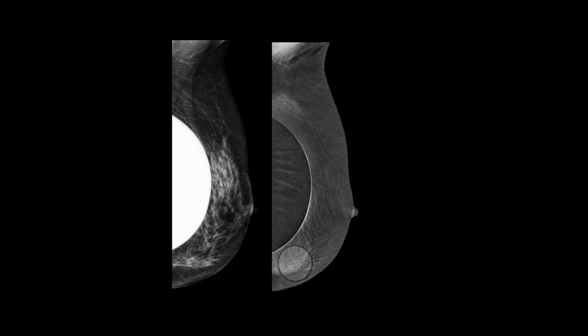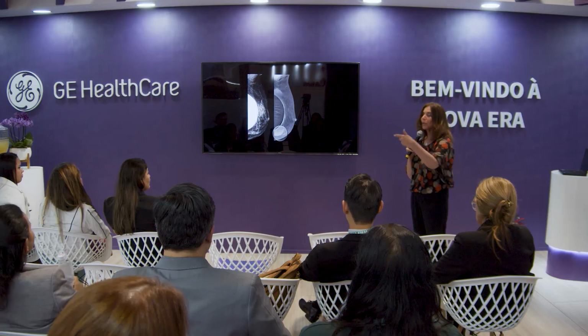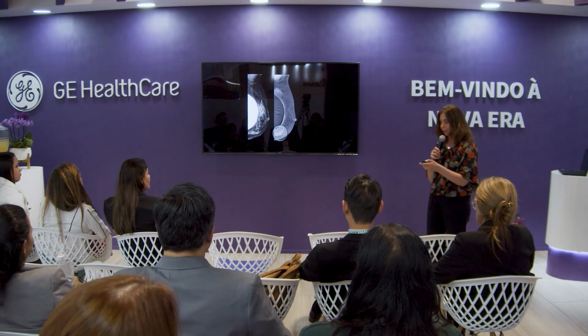And implants. If there are no good implant displaced views, we might get these artifacts, which are similar to the breast within breast. In this case, there is actually a cancer hidden there that we couldn't appreciate. The only reason we could appreciate it is because we saw some asymmetry on the low energy view. Again, the diagnosis is made based on both recombined and low energy views and comparison to prior. So by all of that, we can compensate for everything.